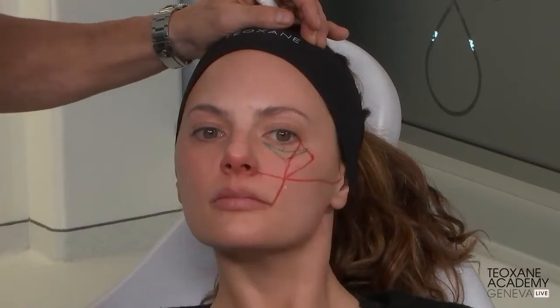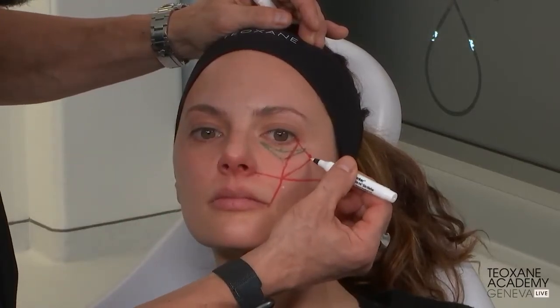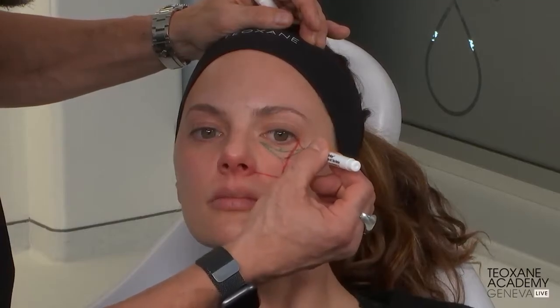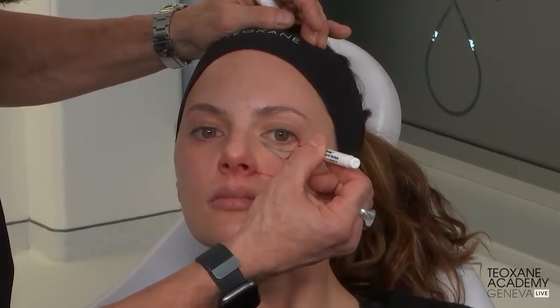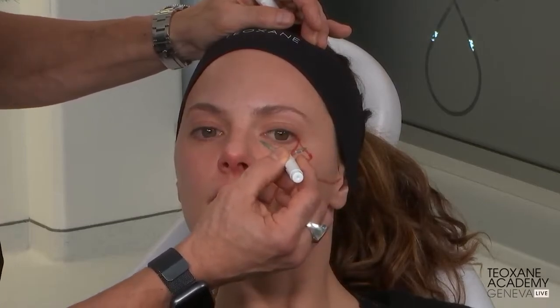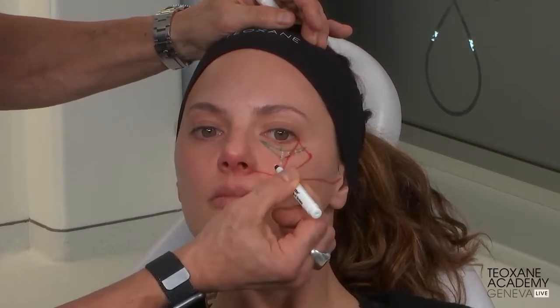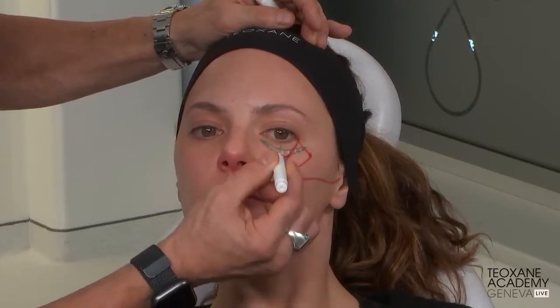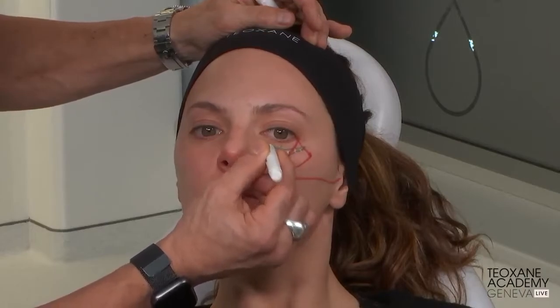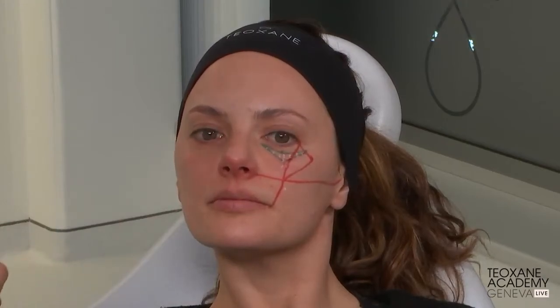I prepare myself with an algorithm of treatment. This is the first point of injection, the G point. Then I go to the orbital contour padding. It is 3 points lateral. Then there is the center, the apex of the V deformity, which is 3 vertical, and then we have 3 medial points. So this is, I will tell you the quantity. This is my baseline algorithm for the treatment of the infraorbital region.